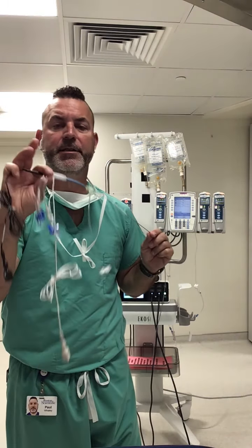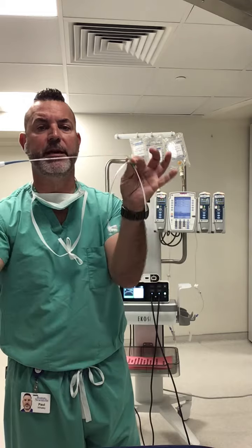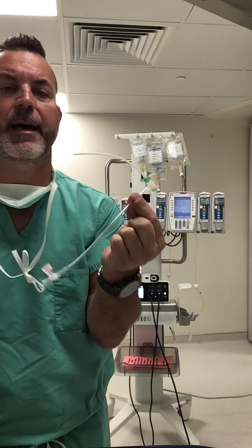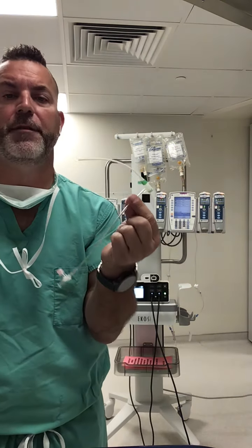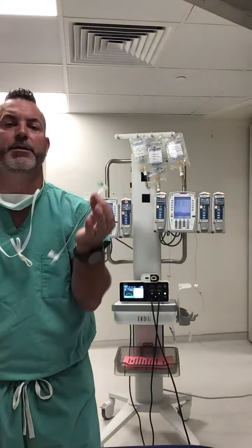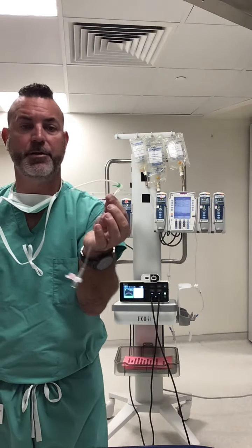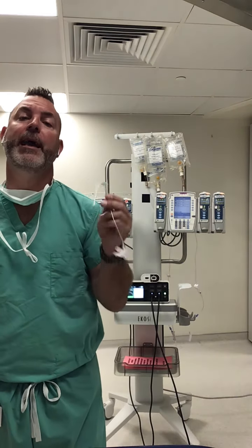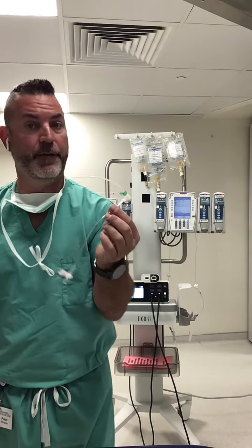My catheter is going to take 2 fluids, and then you're going to have something else that takes the 3rd fluid. Let's talk about this guy for just a minute. This is a 6-French sheath. Most of us in the IR cath lab and OR worlds know this, but if you're unfamiliar with this, nurses, just know that this is an introducer sheath. This is not part of my device, but you're going to see this on every EKOS patient, and more times than not, you're going to see a fluid flowing through here, okay?